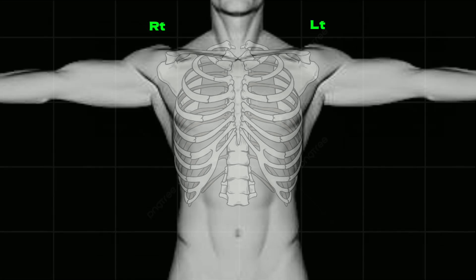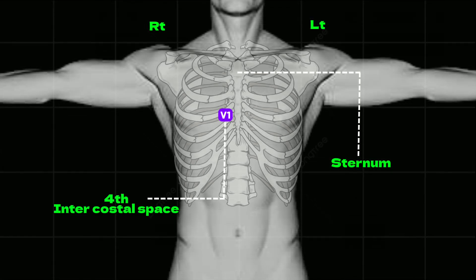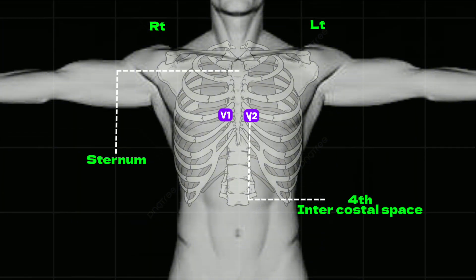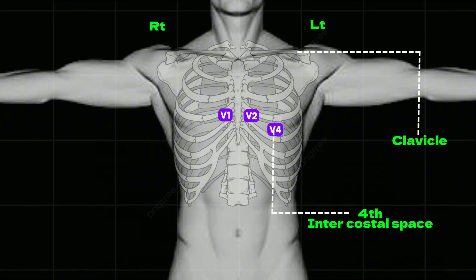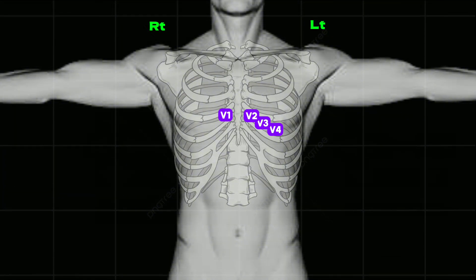In chest leads, V1 is attached at the right side of the sternum at the 4th intercostal space. V2 is attached at the left side of the sternum at the 4th intercostal space. V4 is attached at the mid-clavicular line at the 5th intercostal space. V3 is attached between V2 and V4.